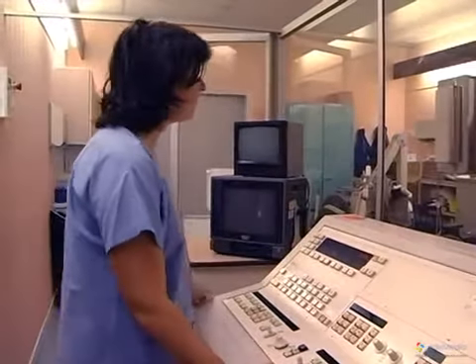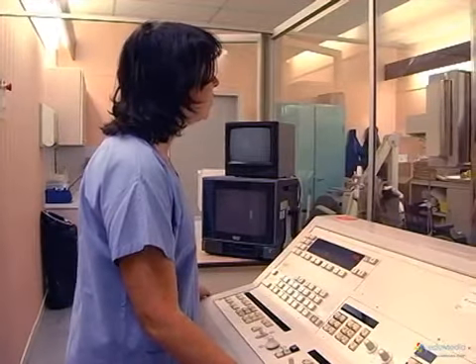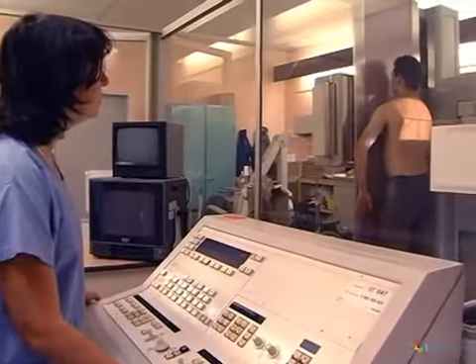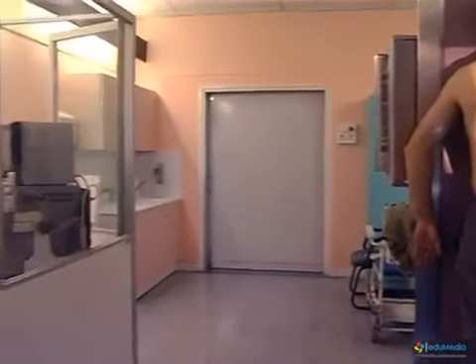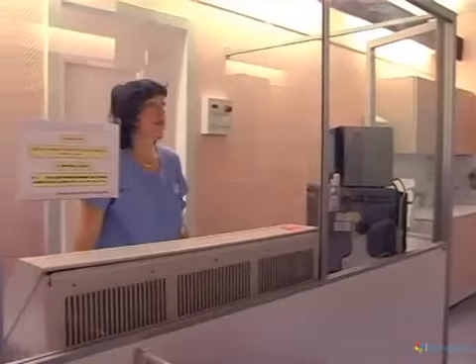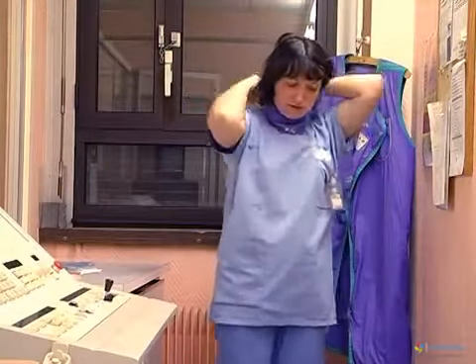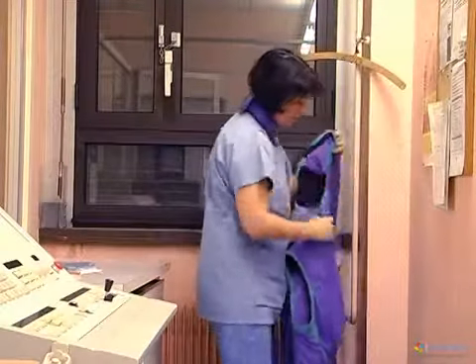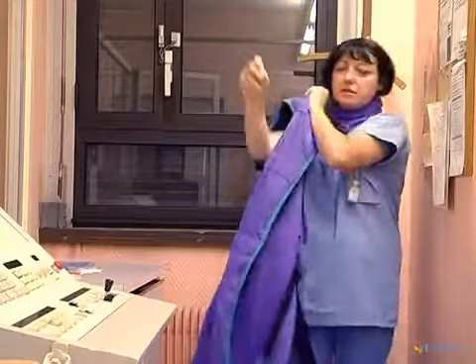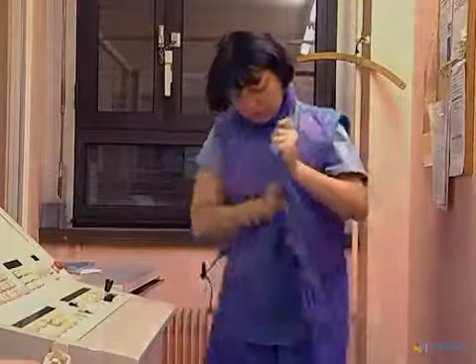The personnel, who are themselves exposed to a chronic risk, are of course protected. At the precise moment of the irradiation, they are behind a leaded screen that blocks the radiation. If his or her presence beside the patient is necessary, then the medical professional wears leaded gloves and a leaded apron. Furthermore, the iodine-based contrast media can provoke allergic reactions in some patients.